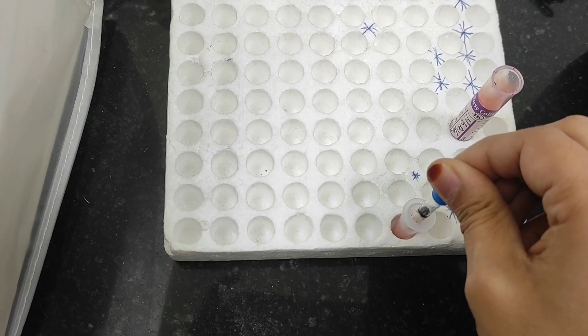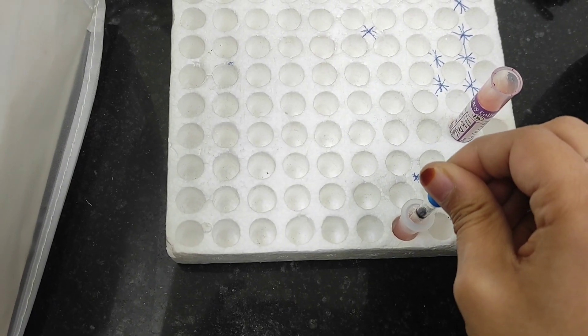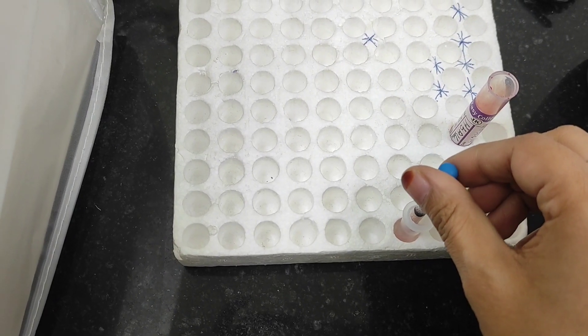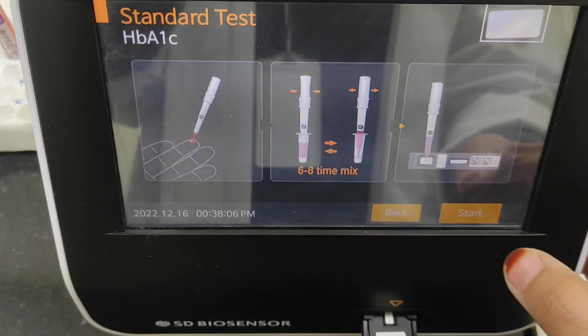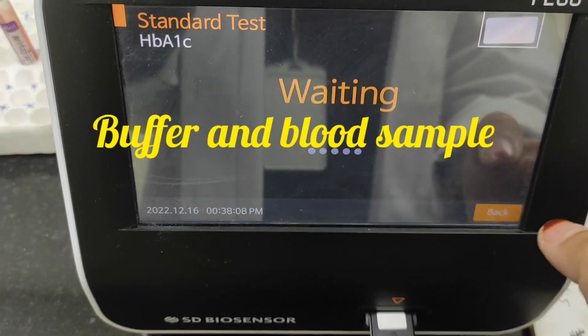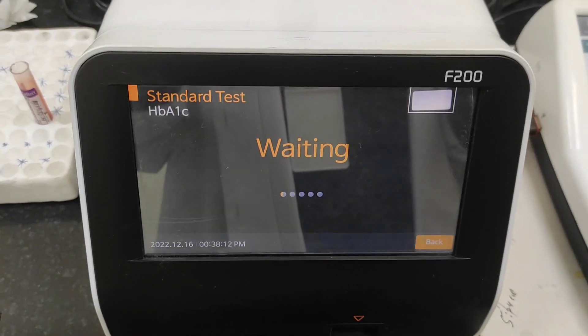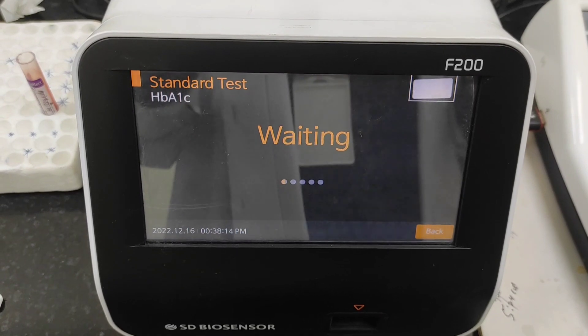It's very important to wipe the tip of the dropper. Then mix six to seven times with the buffer. Now we will dispense the mixture into the cartridge region and press start. Here you can see the result on the display.